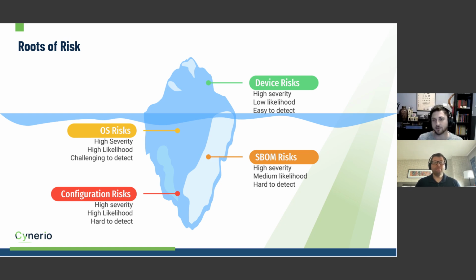Attackers generally prefer utilizing vulnerabilities that are much more generic, that require a lot less effort, that don't require them, for instance, to study a specific kind of CT device and how the proprietary medical protocol there works, and then look up some other security firm's research and realize how to implement that. That's a lot of work for a hacker, right?